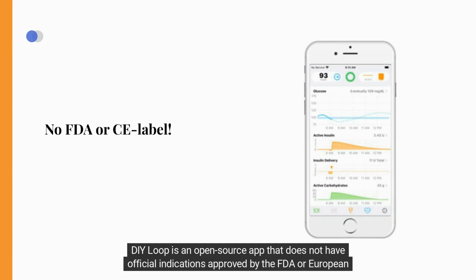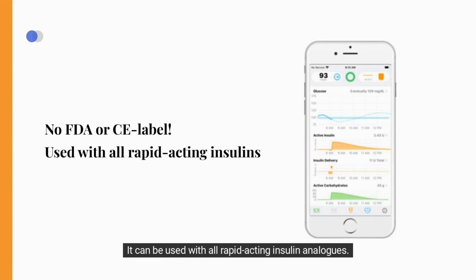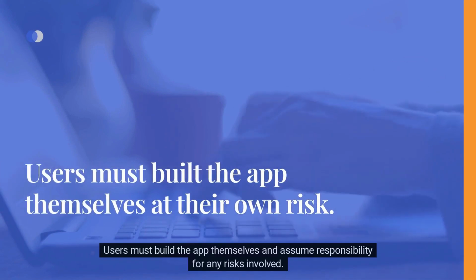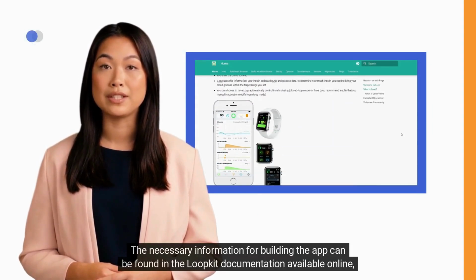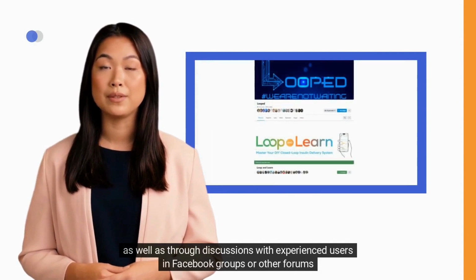DIY Loop is an open-source app that does not have official indications approved by the FDA or European authorities. It can be used with all rapid-acting insulin analogs. Users must build the app themselves and assume responsibility for any risks involved. The necessary information for building the app can be found in the LoopKit documentation available online, as well as through discussions with experienced users in Facebook groups or other forums.